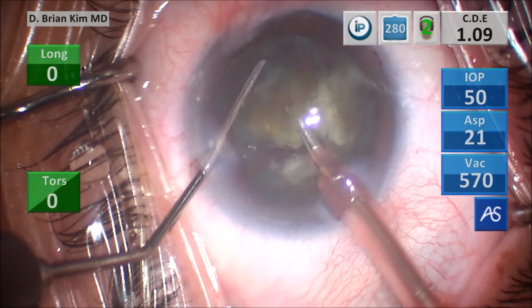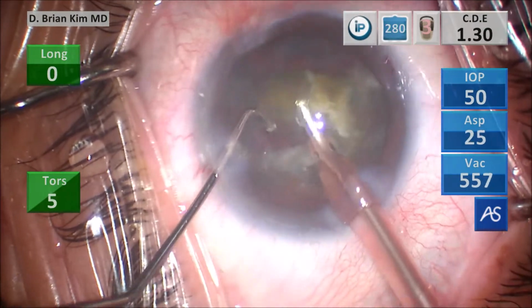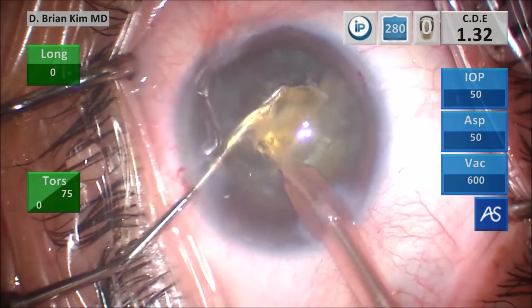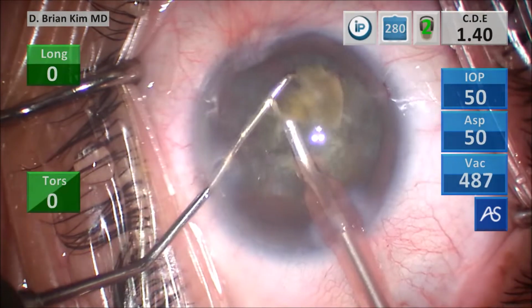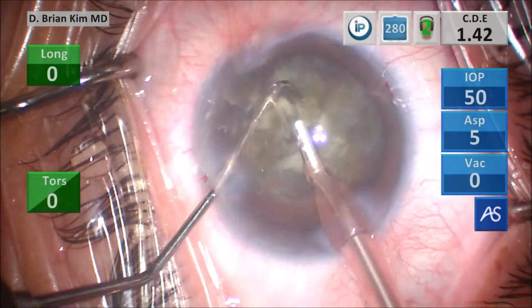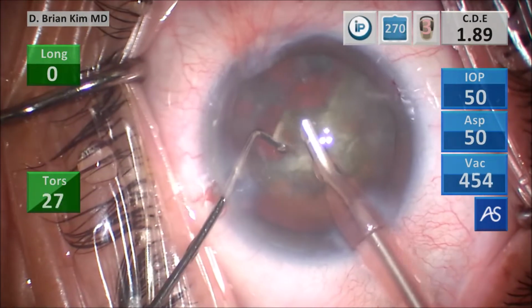You can see, again, doesn't want to come up, very sticky. Again, not a plate per se, but just sticky adhesive lens material. And so by using mechanical forces, you're able to get around the lens and crush the lens and pull the lens pieces up, much more efficient and much more safe than trying to go after lens pieces with high vacuum. You never want to put the phaco tip deep in the bag and apply high vacuum. That's always a bad technique.